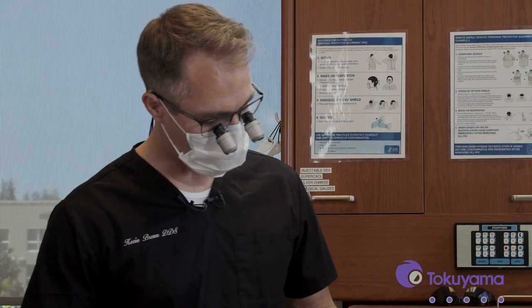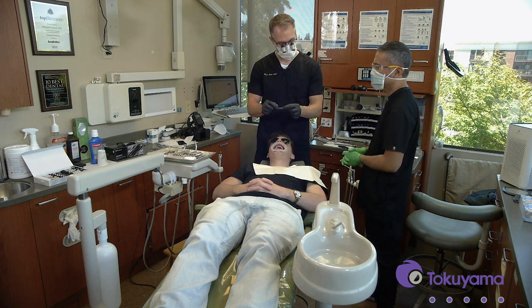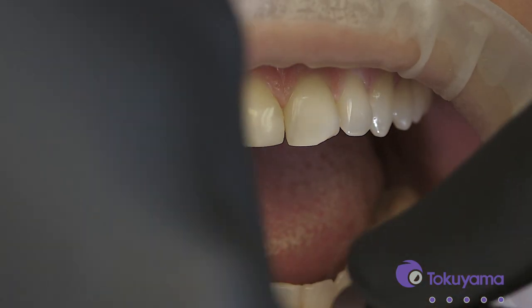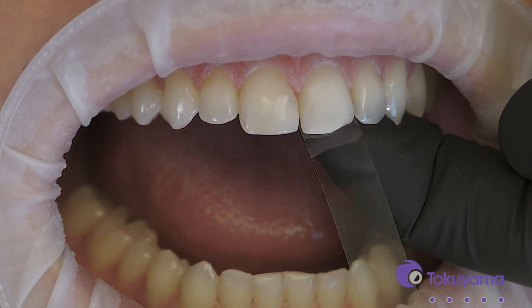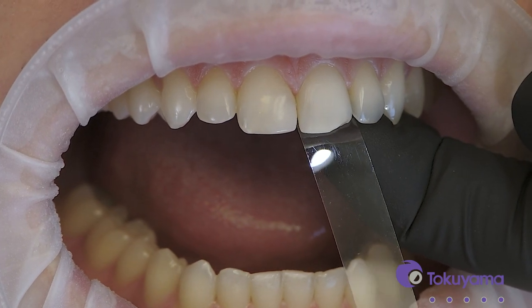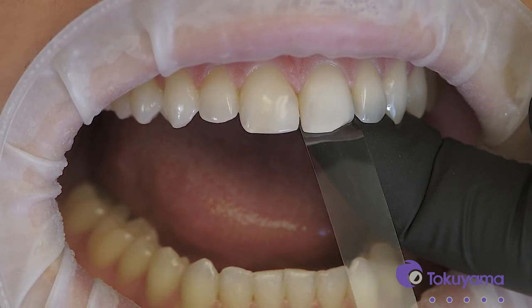There are a few different techniques on how you can rebuild an incisal edge — you can freehand composite on there, but if you have something to guide you, it really helps. This is probably the most simple and basic way to do it: it's just a clear mylar strip. You hold it right on the backside, get this first layer started with your instrument and cure it, and then once you get that on you don't need the mylar anymore — you can just layer on from there.